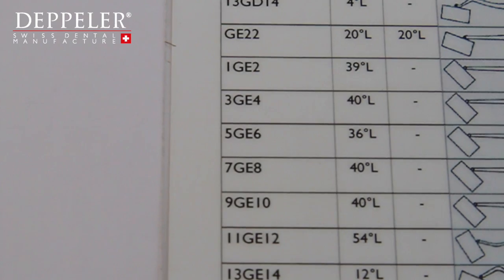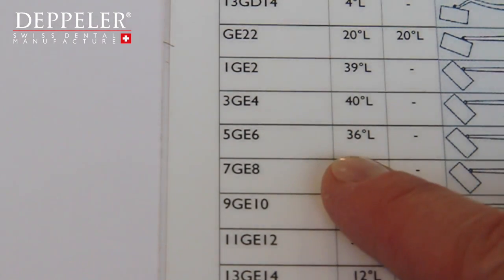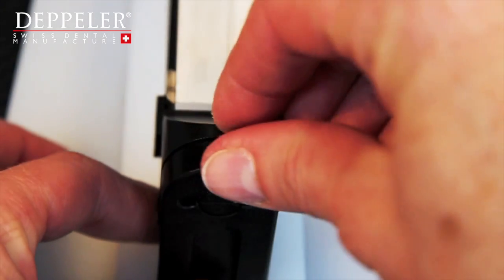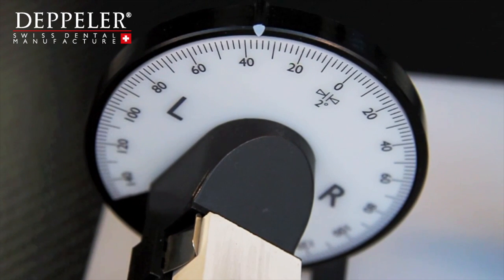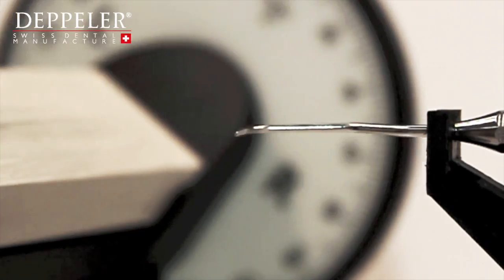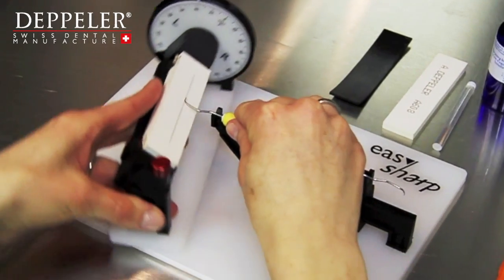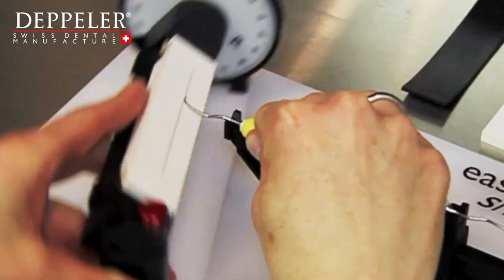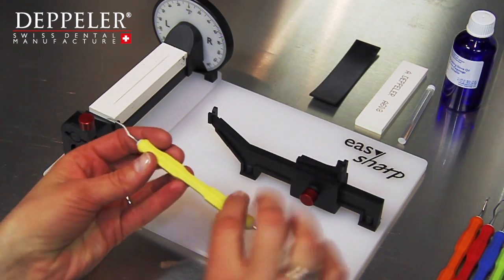Now let's take a Gracey 5-6 curette. The method is the same. Find the corresponding reference on the list. Adjust the angle. Check the angle, check the blade's position on the stone and the movements to be performed. Always bear in mind that you want to follow the curve of the blade. The sharpening of a Gracey 5-6 curette is carried out in less than 30 seconds.